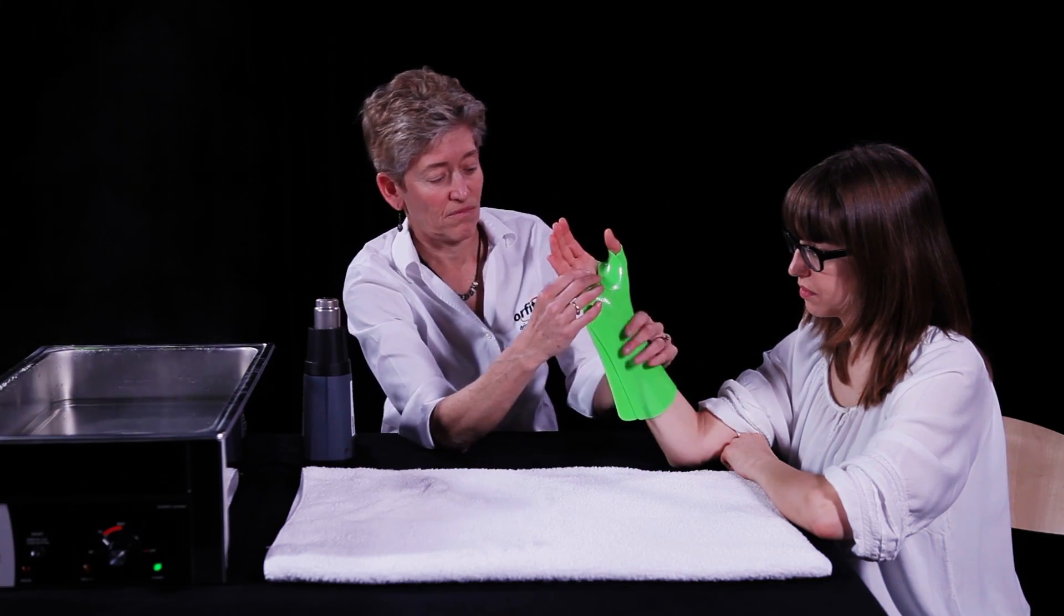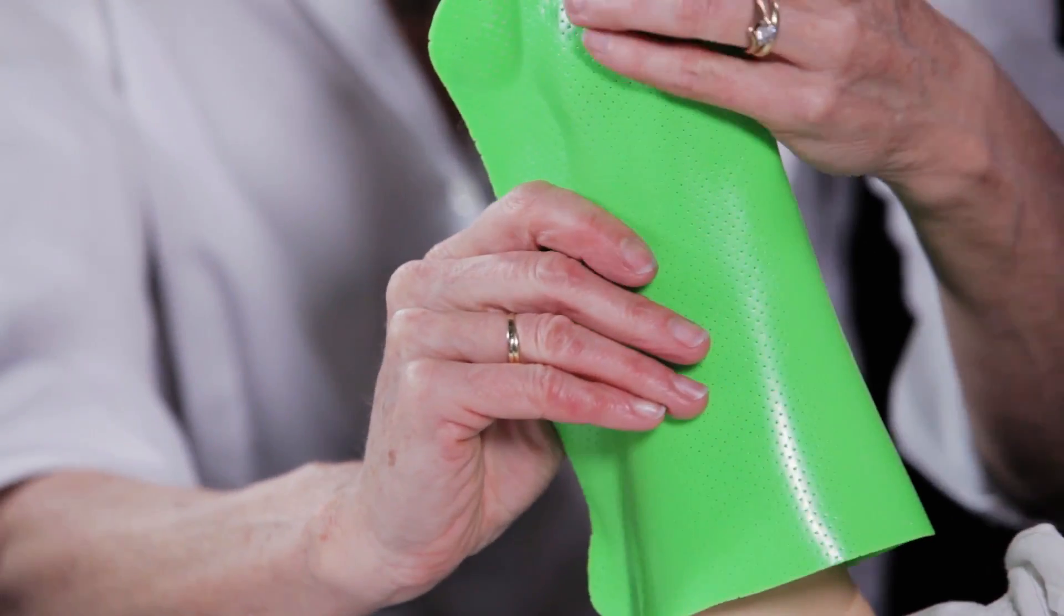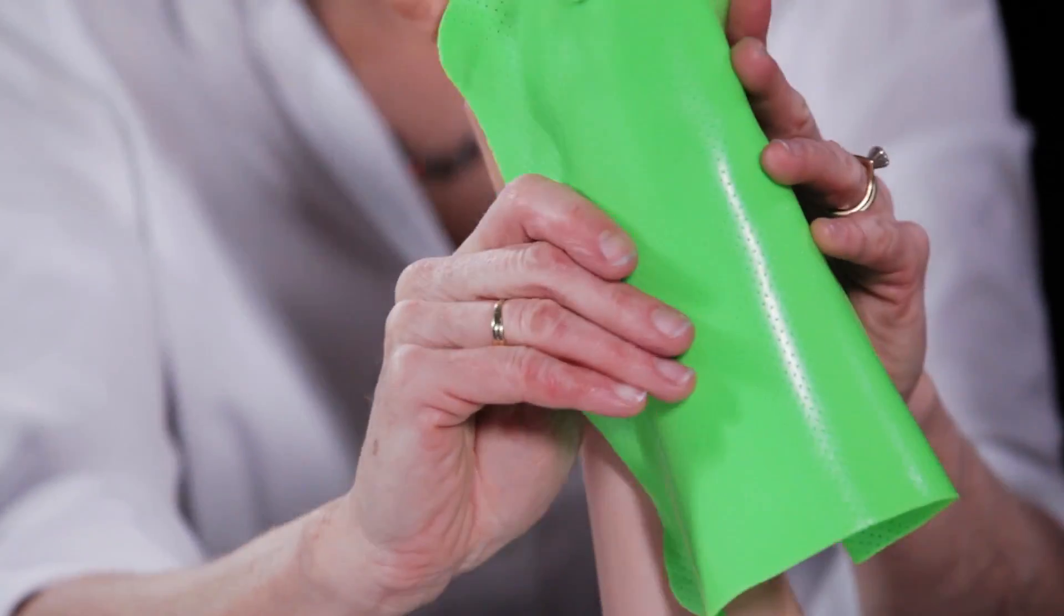When cooled and hardened, the material can be pulled apart along the ulnar border. Remove the orthosis from the patient for trimming.